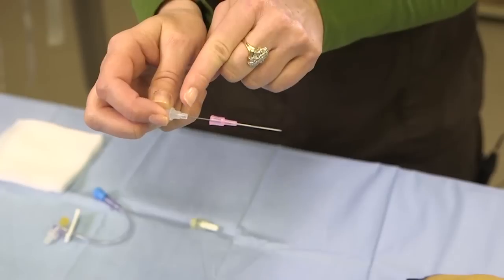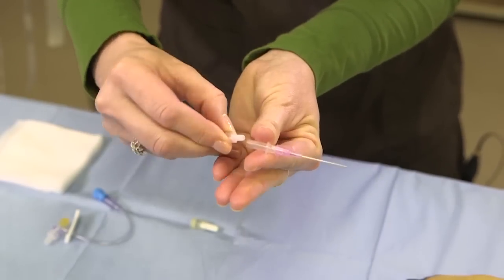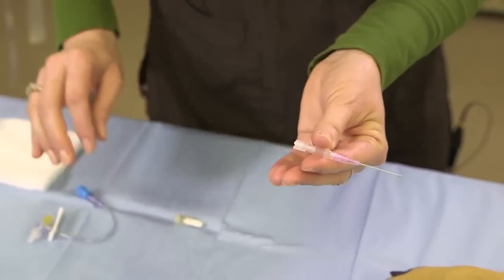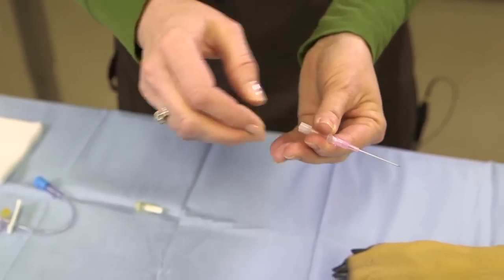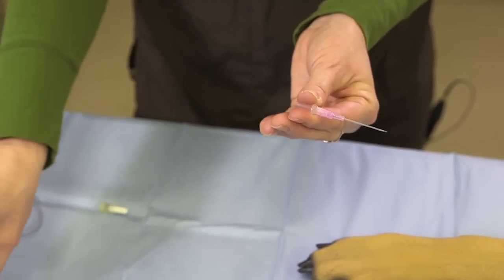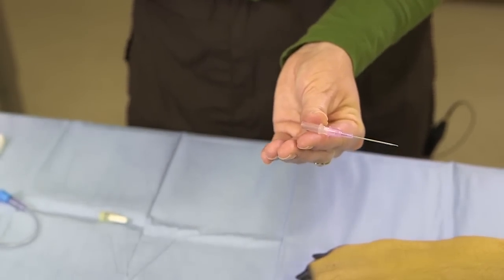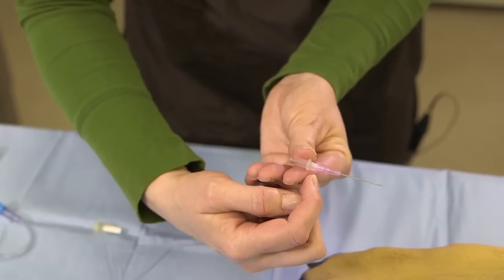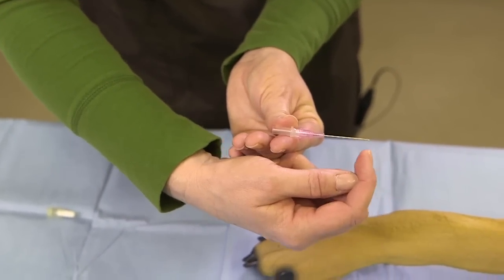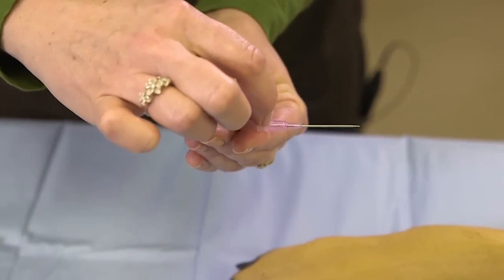This portion is the stylet, and then you have your cap. When you are about to place the catheter into the vein, go ahead and take off your cap — that will allow the blood to freely flow into the stylet. When you're in the vein you'll want to see this portion of your catheter because the blood will come into your stylet and will enter your hub. When you have blood in your hub, you know you're in your vein.